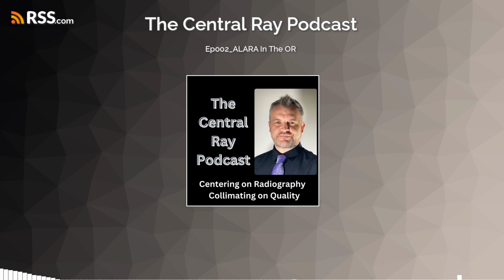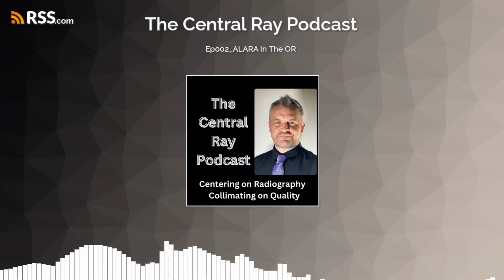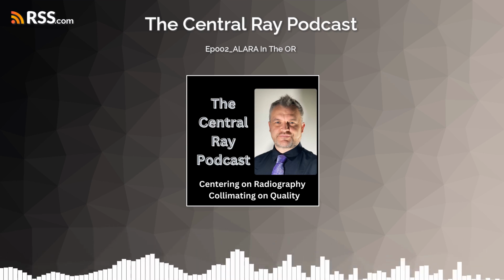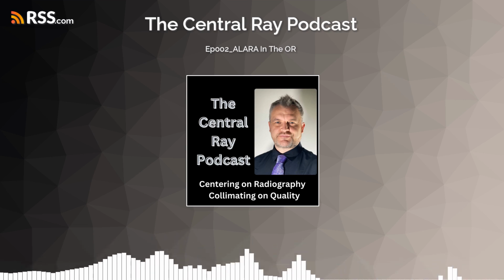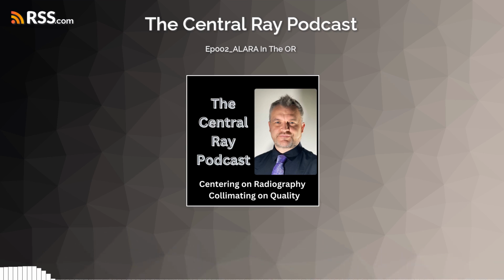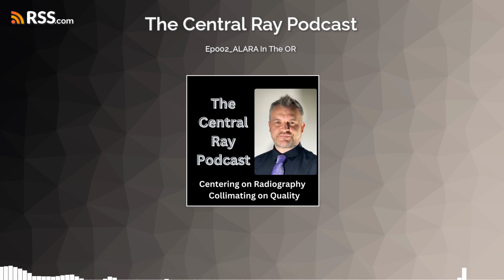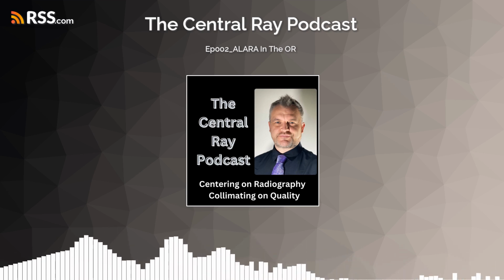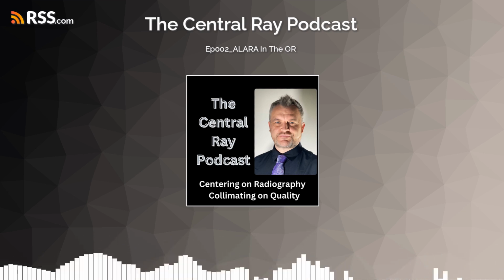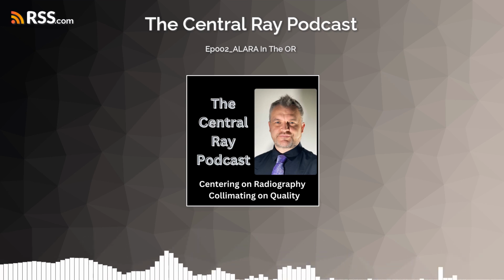for the surgeon. So rather than dropping our height so that we can decrease our OID, getting that image fulcrum is the much bigger benefit to the overall case. And therefore, for ALARA to the patient, you have to look at the assessment of the overall risk of the situation. My history is in trauma imaging, so it was imperative that our surgeries took as little time as possible due to the increased risk from anesthesia on our patient population.